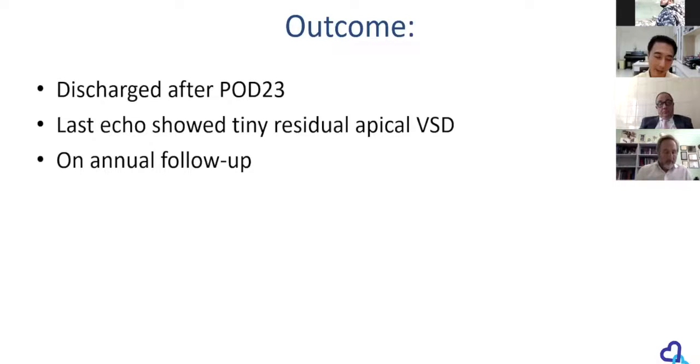So I do find that for an apical VSD, the MFO is actually a very nice device to sit in. If you put any muscular device, it might not sit that well. And the RV disc is actually a very soft device, and it can conform nicely with a lot of trabeculation and the moderator band there. So I find that the MFO device sits very nicely. So far I've done 2 apical VSD by perventricular closure, and the device is perfect for apical VSD.